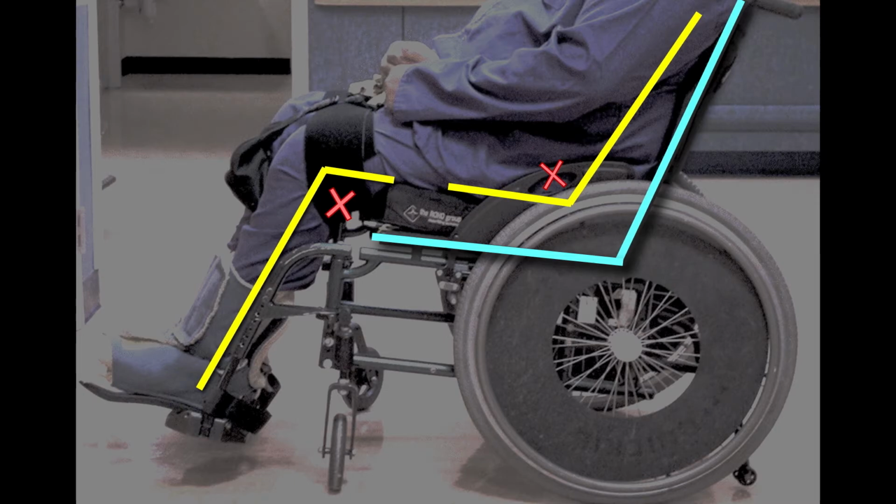But when you looked at the effects of the HO, his hip angle was actually a little bit greater than the chair, and his knees weren't going farther back. And he had a chronic wound on the back of his heel with osteomyelitis for years and years. And we kept replacing this chair and nobody was actually doing much of it. They were assuming and not assessing.